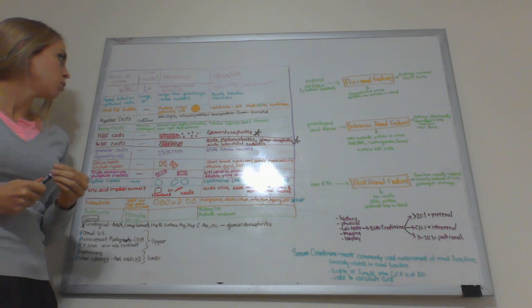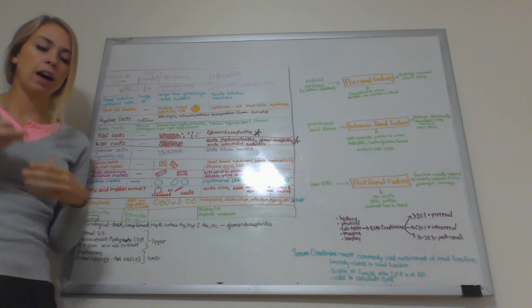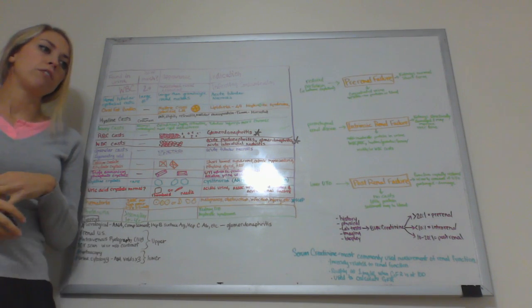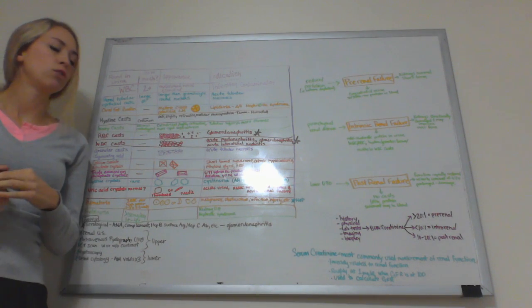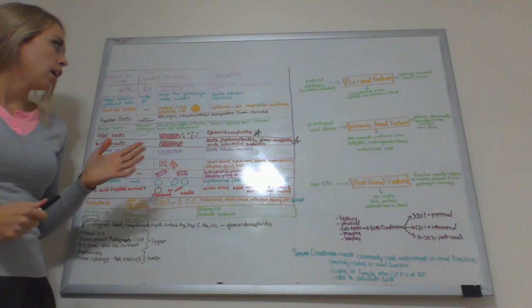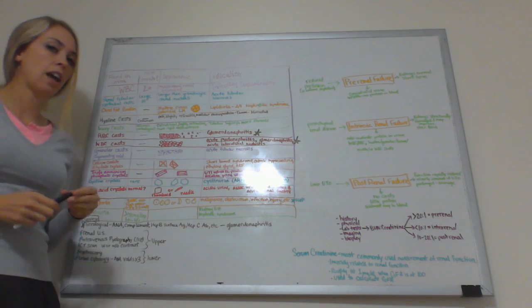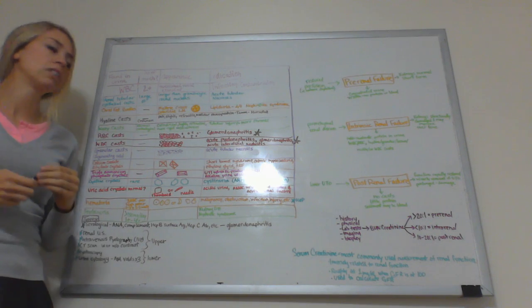Next, I want to talk about renal tubular epithelial cells. A small amount of those cells come out normally, but if you have a high amount of those, that would be concerning and could indicate acute tubular necrosis, because the tubes are just shedding those cells. They appear larger than the granulocytes, and they have a round nucleus versus the lobed nucleus of the white blood cells.